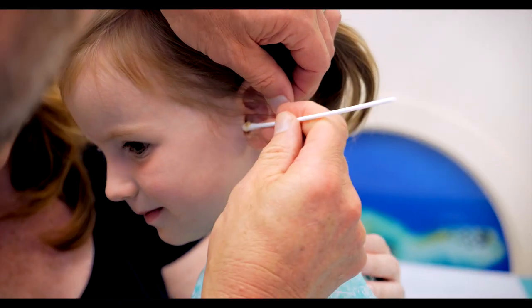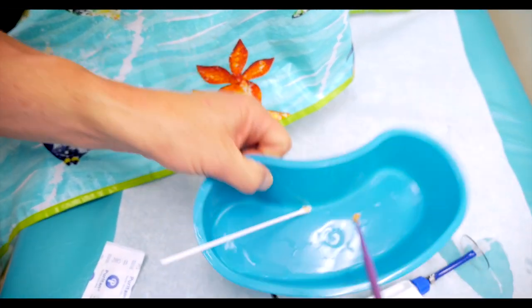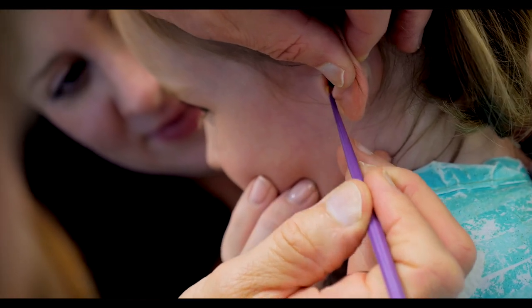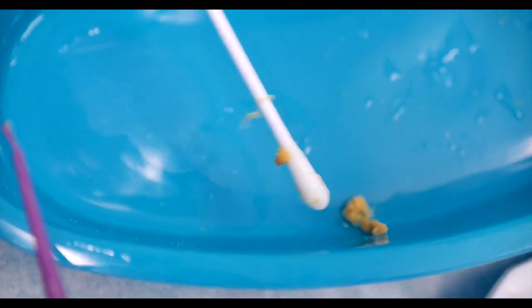Let's get some of this extra old stuff off of there. We'll take a look. There's still more — it doesn't want to come off. All that is in her little tiny ears. Come on, wax. There it is, we got some more. Ta-da! It's a stringer. Wax. You might be part bee, because bees make wax.